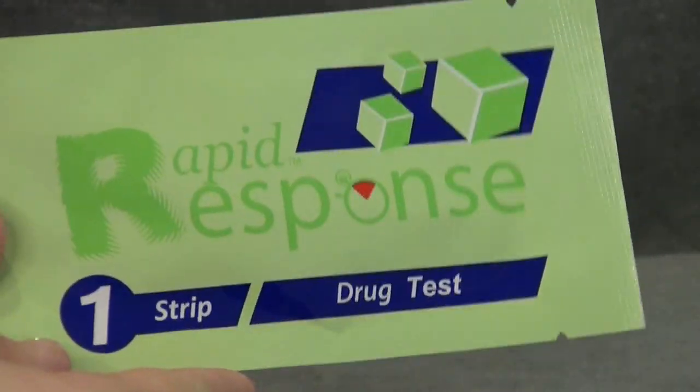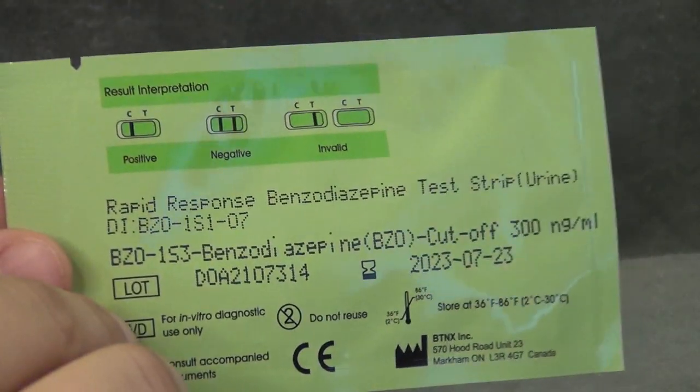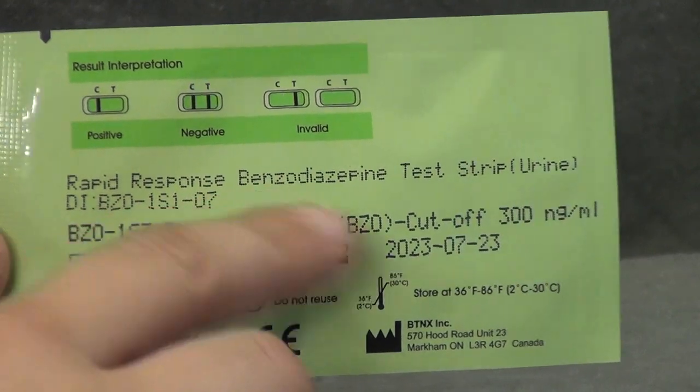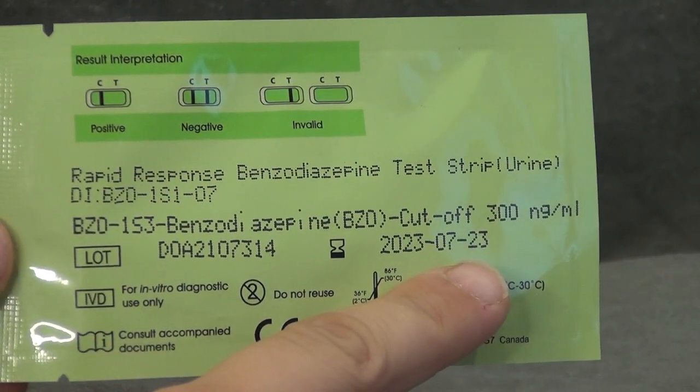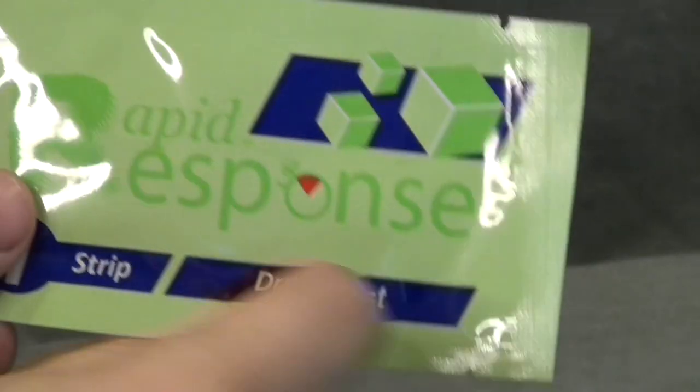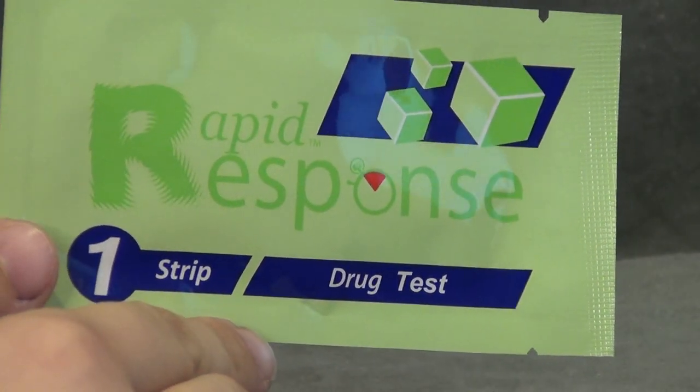Before you prepare your sample for testing, ensure you have the correct testing strip and that it is not expired. Look on the back of the package for the printed substance name as well as the expiry date. Once you are sure you have the correct testing strip, we can prepare our sample for testing.